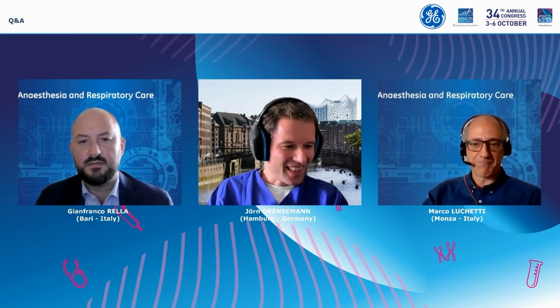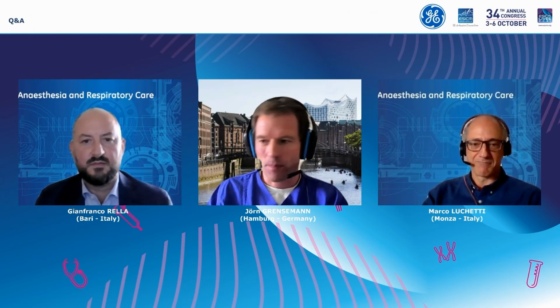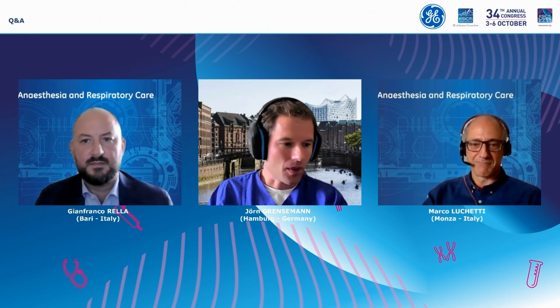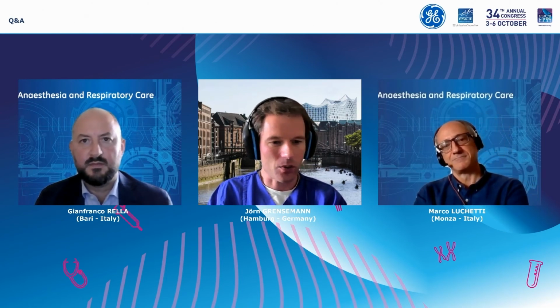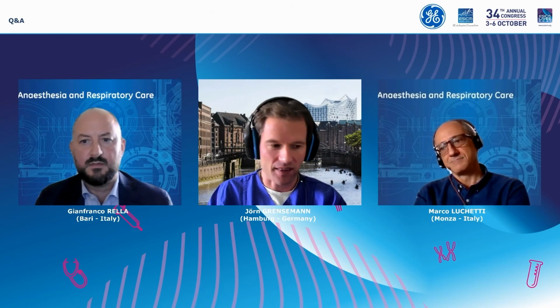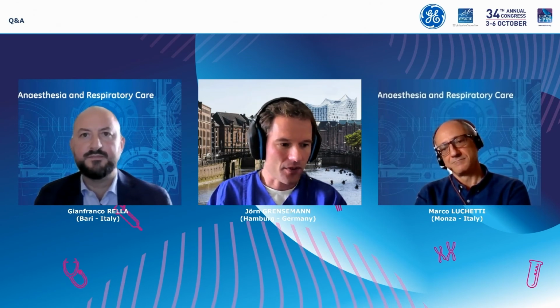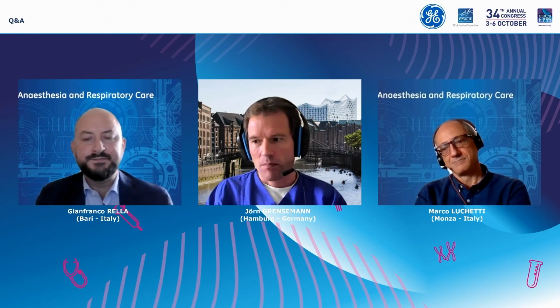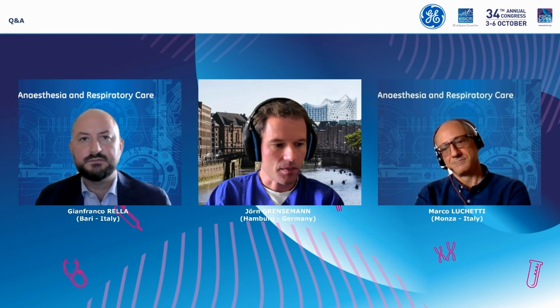Yeah, from a theoretical point of view, it is possible to obtain an estimation of energy expenditure with a pulmonary artery catheter. There are some limitations to it. First of all, you just measure the oxygen uptake and not the carbon dioxide release.